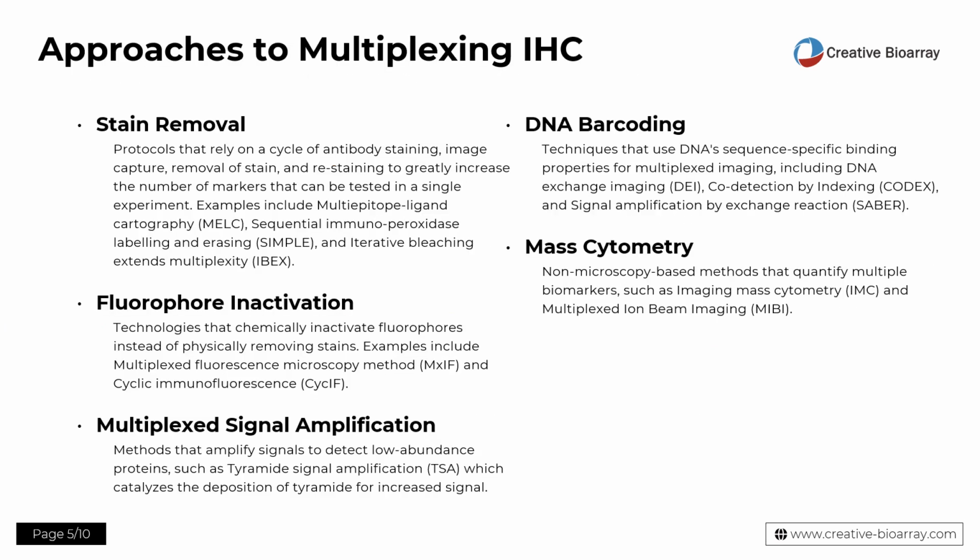In terms of the more advanced, higher-level applications of multiplexing IHC, there are various approaches relying on distinct principles. These can be classified into 5 classes: stain removal, fluorophore inactivation, multiplexed signal amplification, DNA barcoding, and mass cytometry.